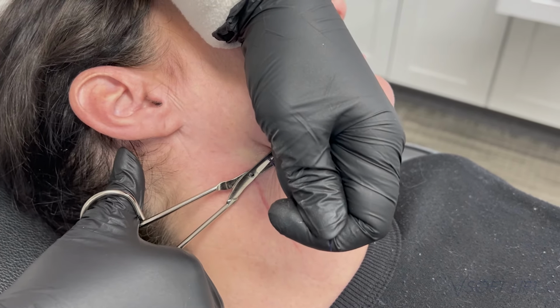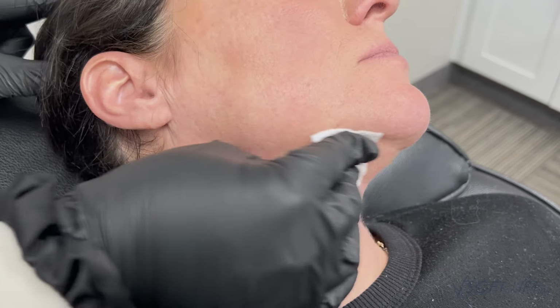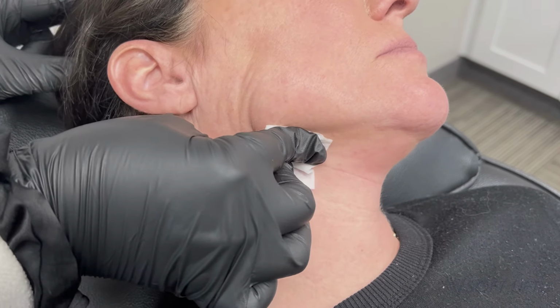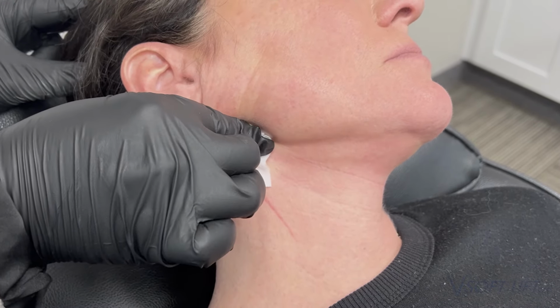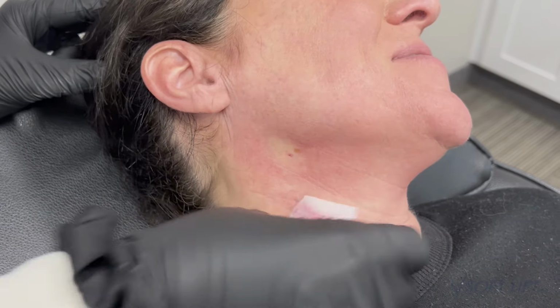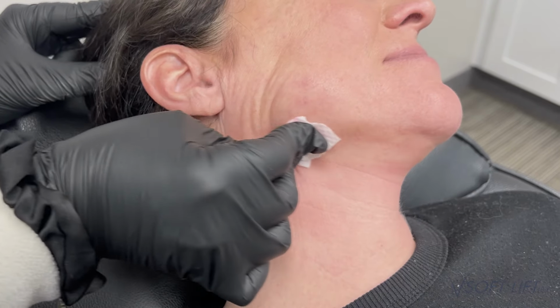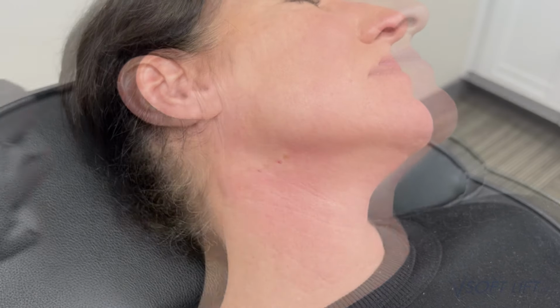And then trimming the thread as close to the skin as possible, making sure she is good and clean, and then always putting a Band-Aid over the insertion site. This patient did really well with the procedure, very quick and easy, and we will see her back at a 4-week follow-up to see her results.